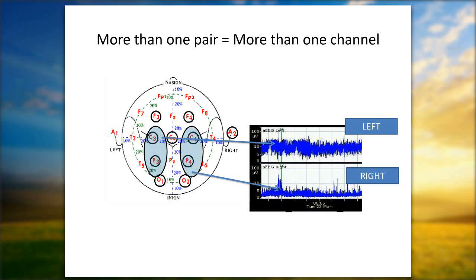So I think that's primarily the reason, because people were really mostly monitoring term babies with HIE when they first started doing this. And so I think that's probably part of the rationale, is just that topography, or the location of injury and ischemia.